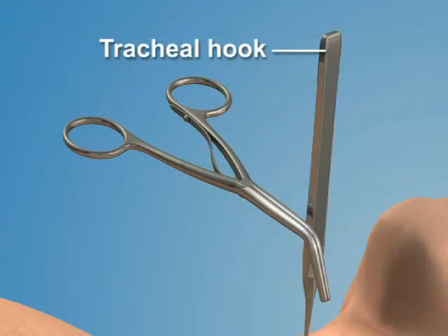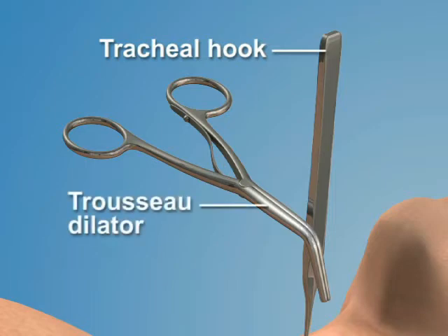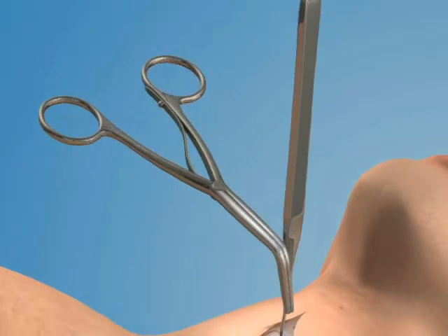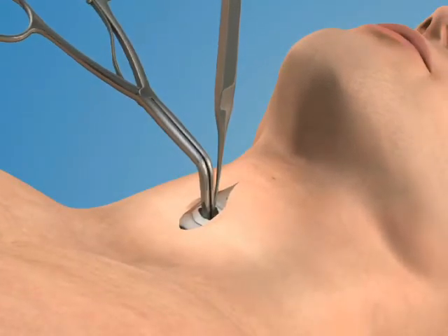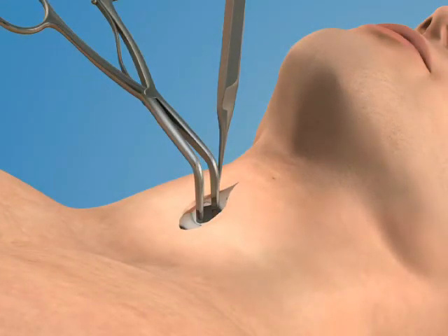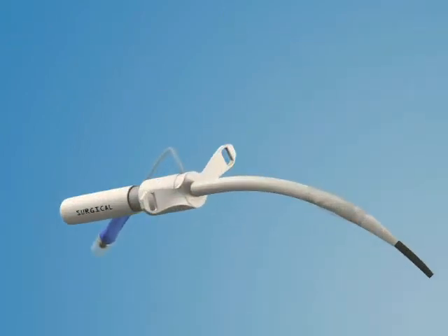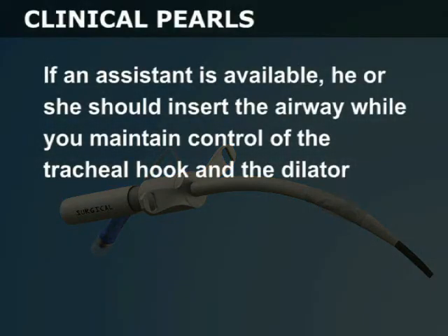While holding the hook with your non-dominant hand, use your dominant hand to place the trousseau dilator into the trachea. Spread the blades open to dilate the opening in a vertical direction. You are now ready to insert the airway into the trachea. If an assistant is available, he or she should insert the airway while you maintain control of the tracheal hook and the dilator.